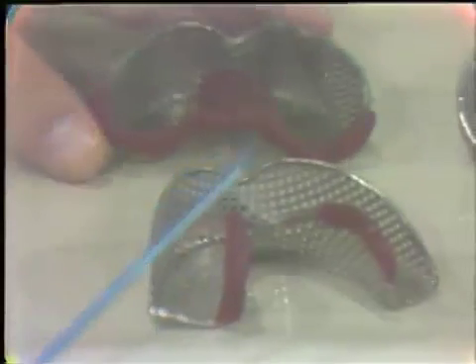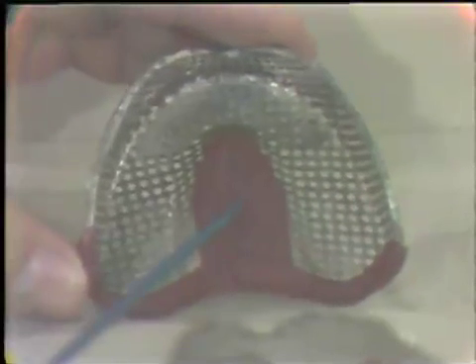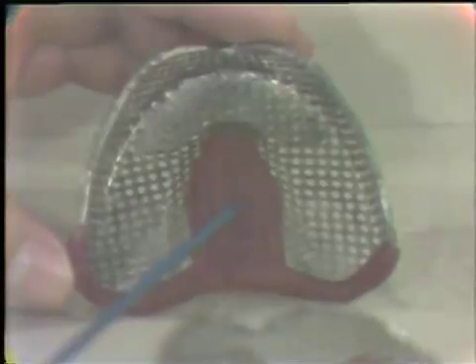Red wax is usually added to both sides to give a good reflection of the tongue and the sublingual gland. The maxillary tray is also altered with red utility wax — red wax in the palatal area to prevent any sagging of the impression material and distortion. This is particularly important for a partial denture impression in the maxillary arch. The posterior is also modified with red wax to contain the impression material so that it does not disappear down the patient's throat and possibly gag them.